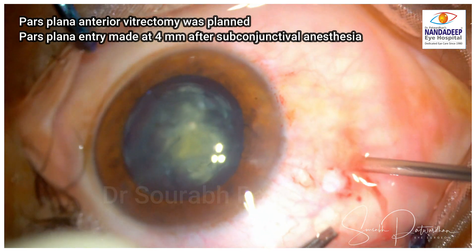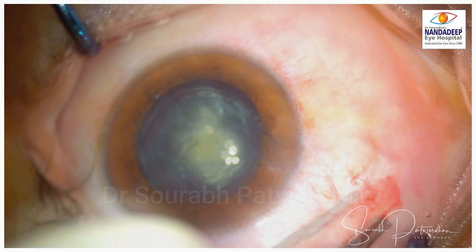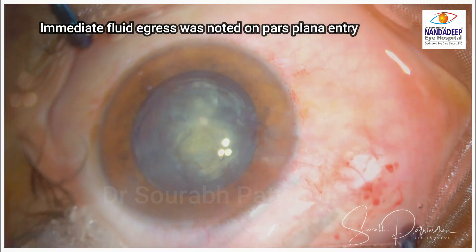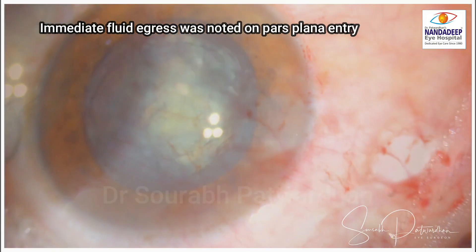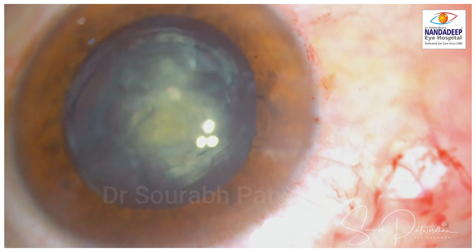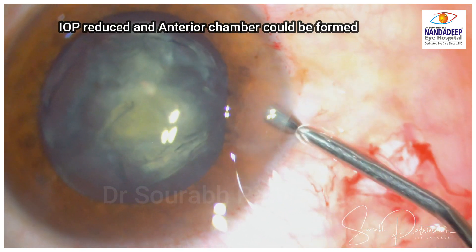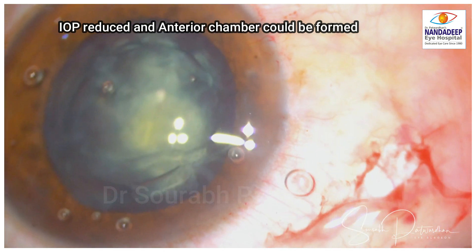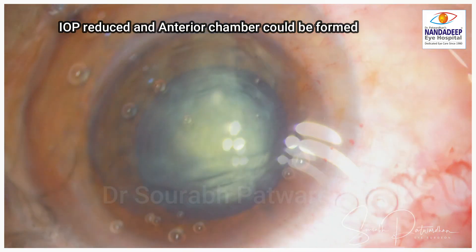I planned a pars plana vitrectomy and made an opening in the sclera 4 mm from the limbus after giving subconjunctival anesthesia. The moment I entered the vitreous cavity, there was a gush of fluid — this was the trapped fluid which came out through the scleral incision. Immediately the IOP reduced and the anterior chamber could be formed very easily with 2% methylcellulose.